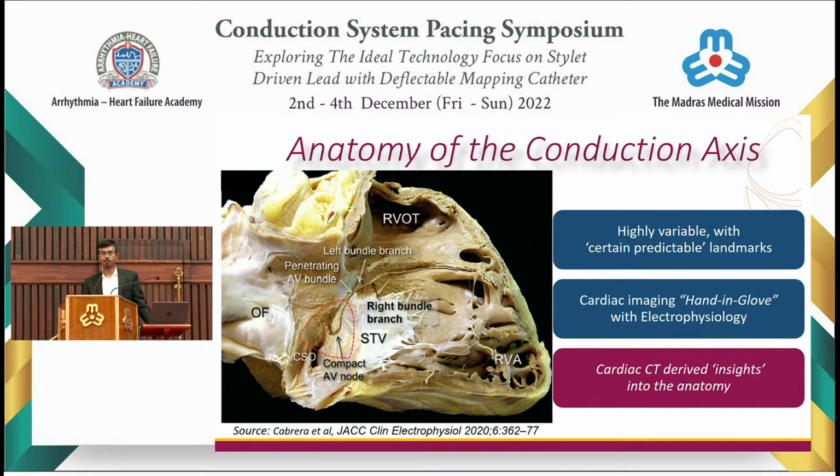there are two studies, one from Dr. Vijayaraman's group, who had explored cardiac CT post-conduction system pacing, and that was in the His bundle pacing group of 51 patients. And the other one was from the Australian National University, where my close friend and colleague, Dr. Abhilash, along with Dr. Rajiv Kumar Pathak and myself, were working on trying to get more insights into the CT scans of these patients who have had conduction system pacing and trying to correlate with the lead parameters.